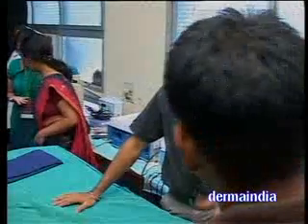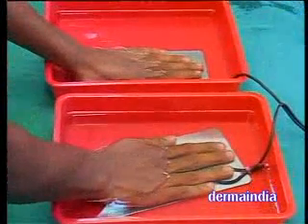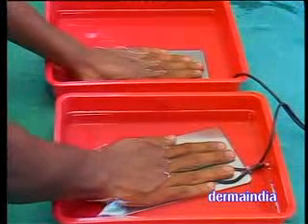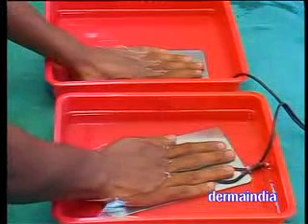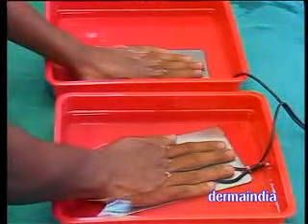Iontophoresis for palmoplantar hyperhidrosis. No metal on the hand. You can increase till there is a mild tingling sensation. Stop it. Leave it for 10 minutes. Then ask him to remove the hands. Change the polarity. Again put it into the chamber. Leave it for 10 minutes.